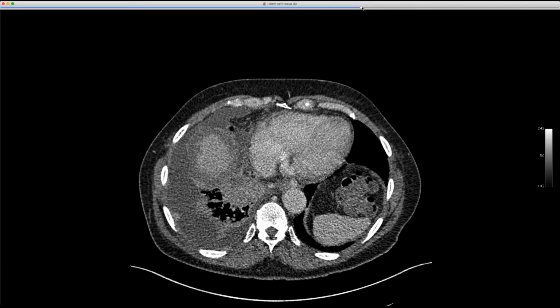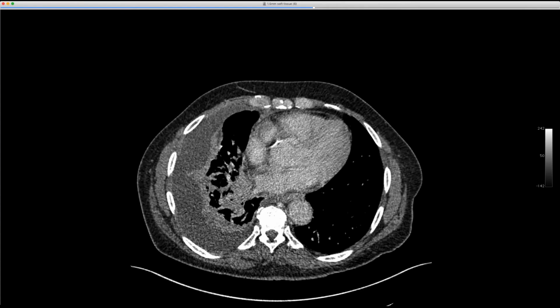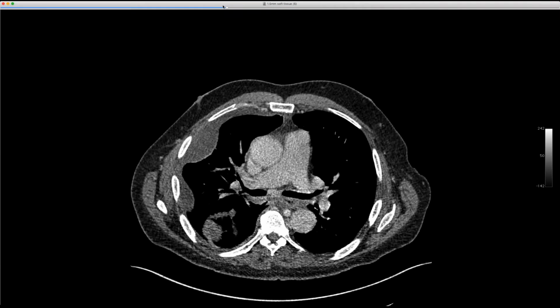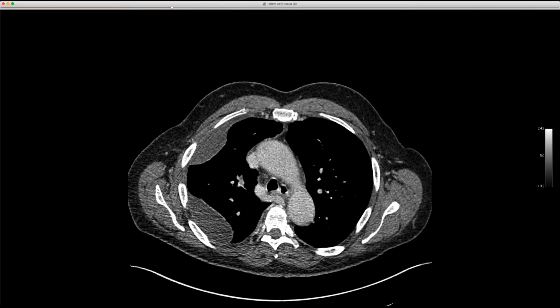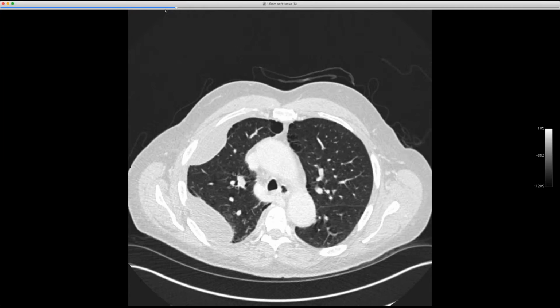So, of course, you'd be concerned about a malignancy. And then this area of denser consolidation in the right lower lobe. So maybe an empyema, but the pleural nodularity is a little disconcerting. But they actually drained this effusion, and they obtained blastomycosis from this, with pleural involvement. This is the first time I've seen significant pleural involvement. I've seen little tiny reactive effusions, but never an empyema.